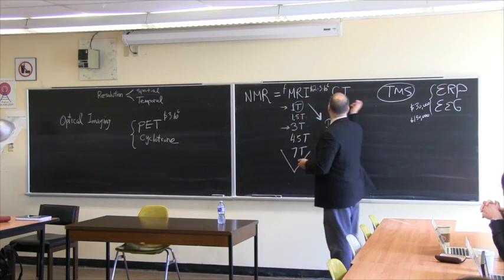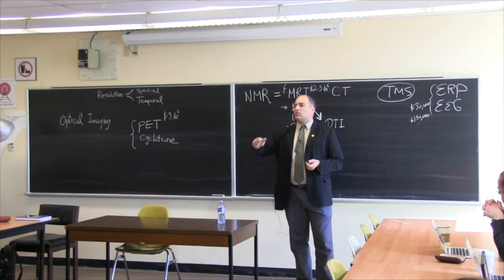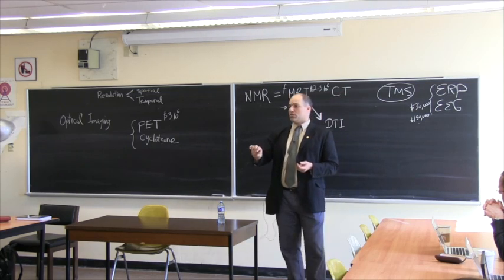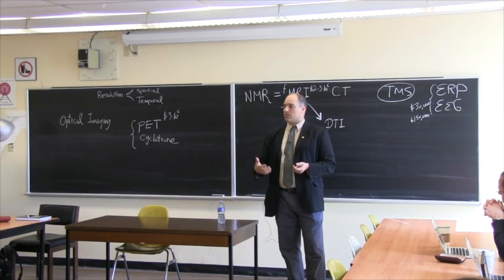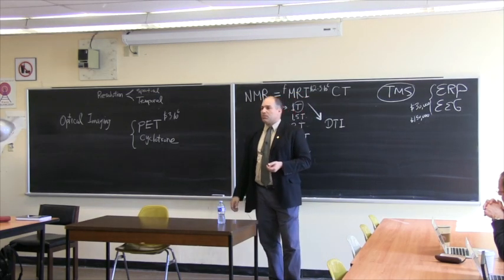And the TMS is adjustable, usually up to 2 Tesla, sometimes a little bit more. So there's a knob and you can control how strong it is. Basically, what you do is you start low and you go slow. You increase it slowly until you see a response. So with TMS, you can actually give people a particular burst on a sweet spot, and their hand would jerk.